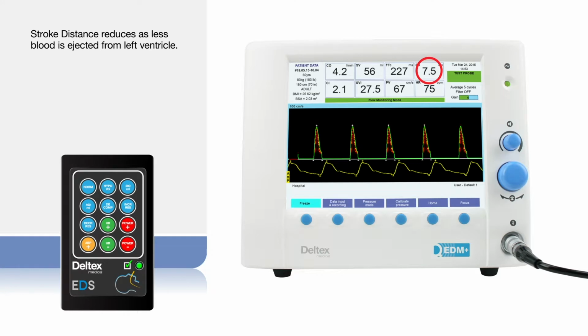The direct measurement of stroke distance has fallen because of the smaller amount of blood ejected from the left ventricle. Stroke volume has reduced accordingly, showing a fall of more than 40 milliliters per heartbeat. In patients, these parameter changes will be specific to the individual.